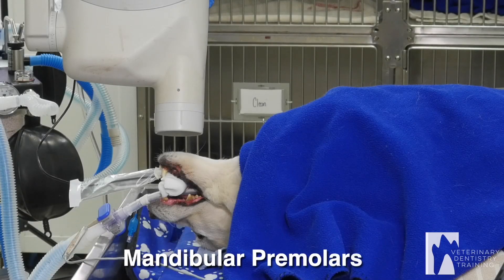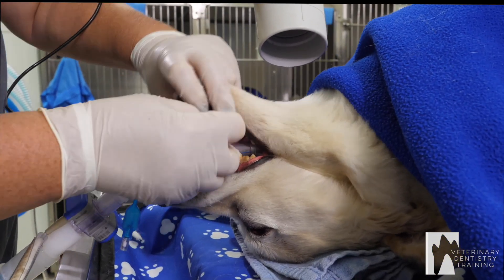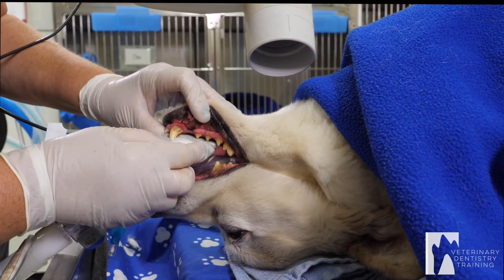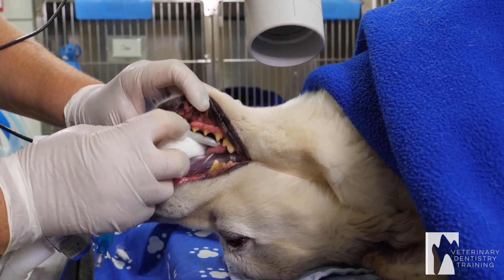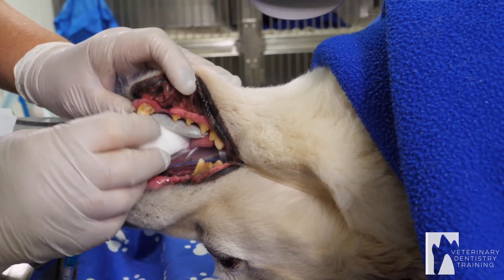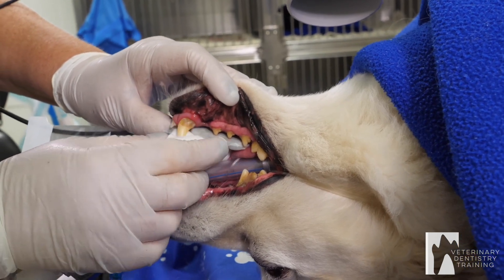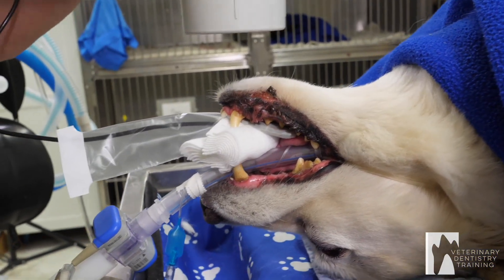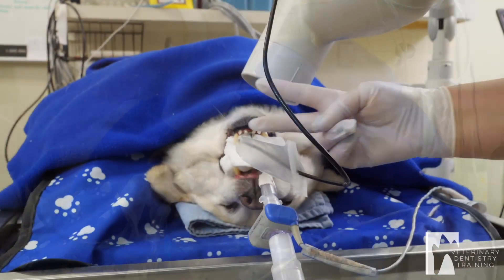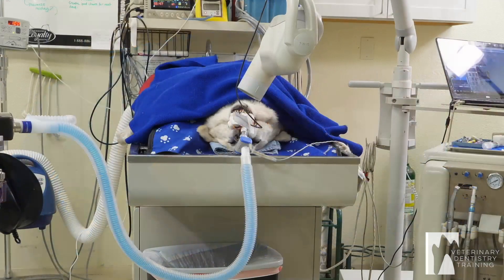Now I'm going to do the premolars — first, second, and third. He's missing some teeth but we still want to x-ray to make sure there's no root tips. The sensor is butted up to the back of the canine, with the long end of the sensor just on the outside of the first, second, and third premolars. Follow the jawline. Then I come in at a peace sign angle looking at it from the front, centering on the root of the second premolar. X-ray.